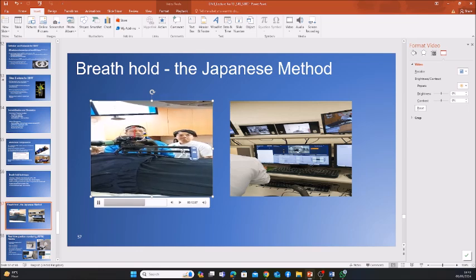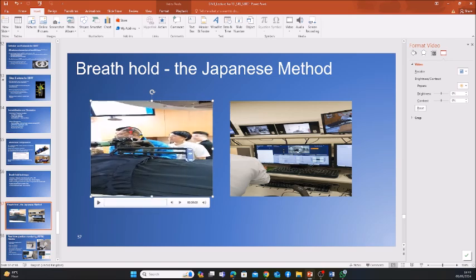This fulcrum keeps the position of the pointer and also moves depending on the breathing. At that time it was not connected to the Linac, so somebody had to keep watching it and stop. But later they said it was integrated with the Linac, so if there is any movement beyond a level, the machine will automatically stop the treatment.